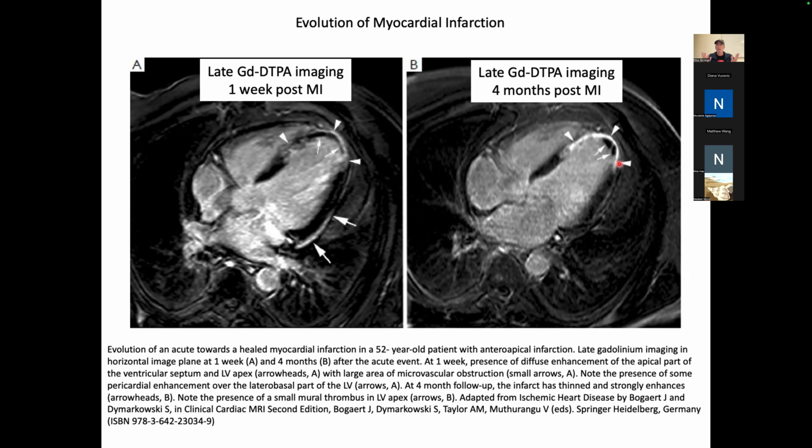So you can plan what you should do for this patient. For instance, if there was a tiny little solid infarct right here, and that was the extent of the damage, and it was quite small, you probably may not need a defibrillator in that patient. In this patient, because there is such a large space of myocardium that is essentially out of commission, which will cause electrical abnormalities, you probably want a defibrillator in this patient.